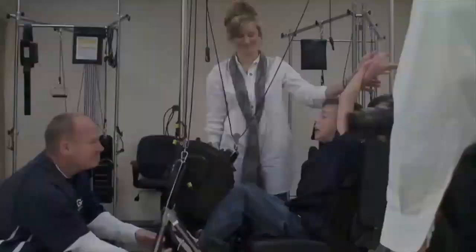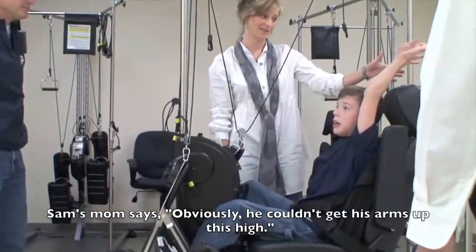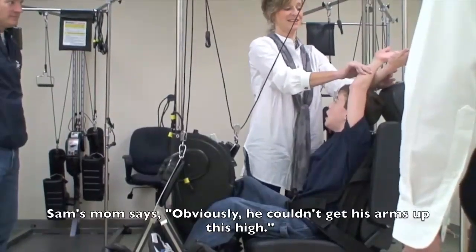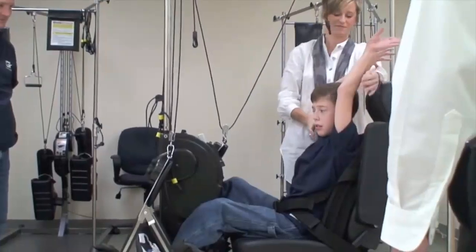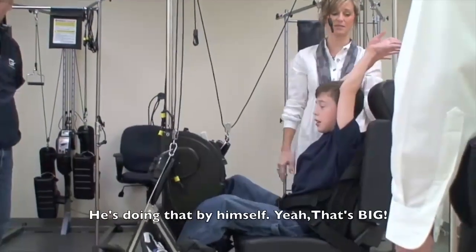Look at those arms — get his arms up that high. That's amazing. Look how straight.